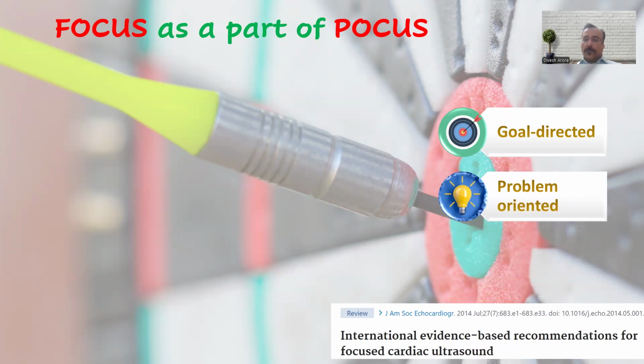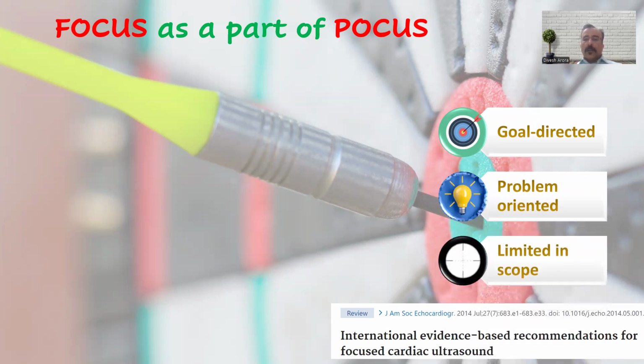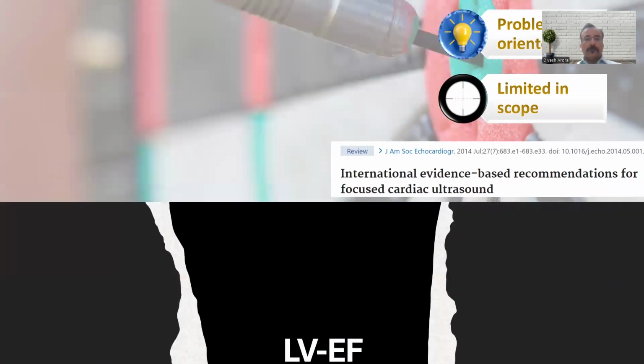Is the patient having normal ejection fraction? Is the patient having a valvular heart disease? And it's limited in scope. We are not going to replace our cardiologist friends. We are doing a focused cardiac ultrasound examination as a part of point of care ultrasound examination.